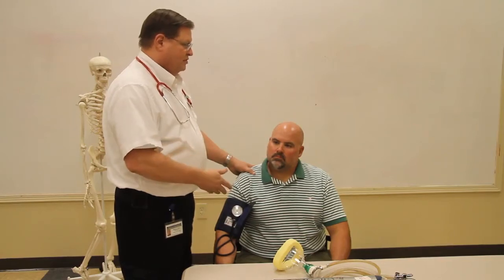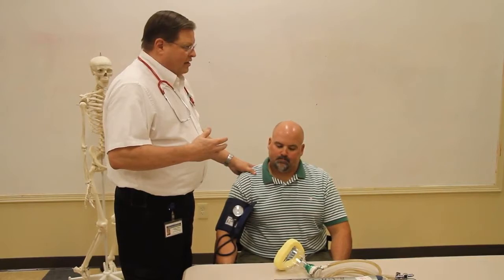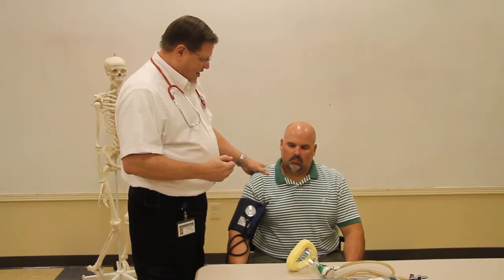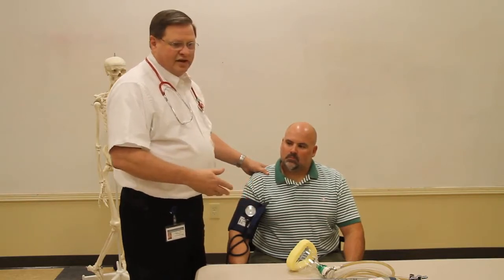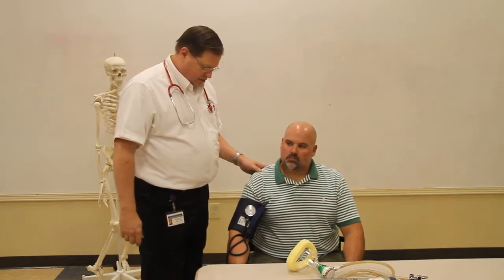And when was the last time you had anything to eat? This afternoon, about 2 o'clock. Have you had any alcohol or anything like that? Any pain medications or anything like that? No. Okay. And then we'll ask about the events, and we'll also ask about pertinent medical history too.